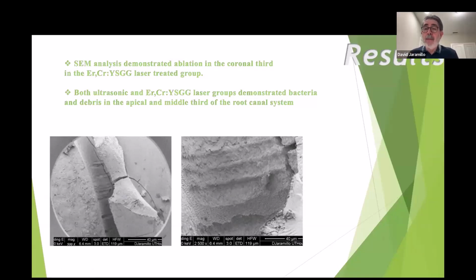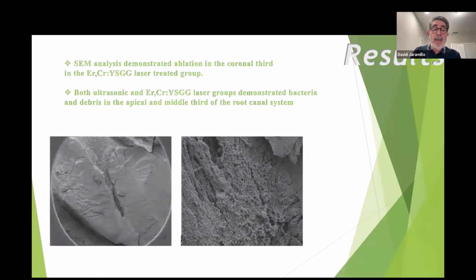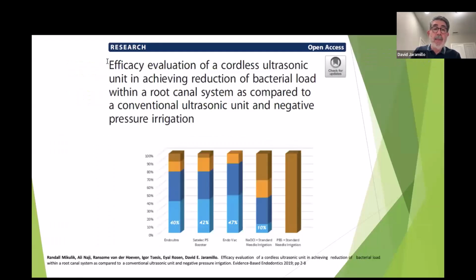So some of the users, and we have it in the clinic, find it hard to take the tip all the way down to the working length. You need to stay halfway, and sometimes the resident creates a ledge in the curve, so they need to keep instrumenting in order to reduce the ledge so they can place the gutta cone. And this is the biofilm created for this research.